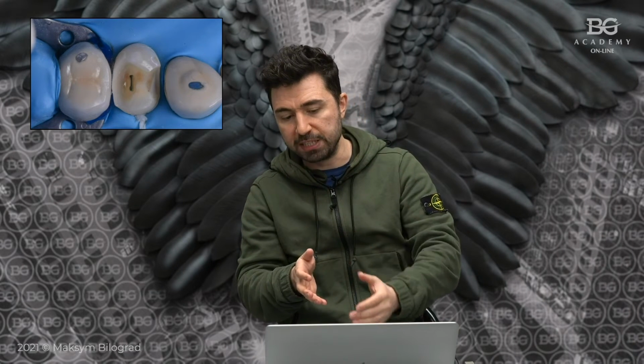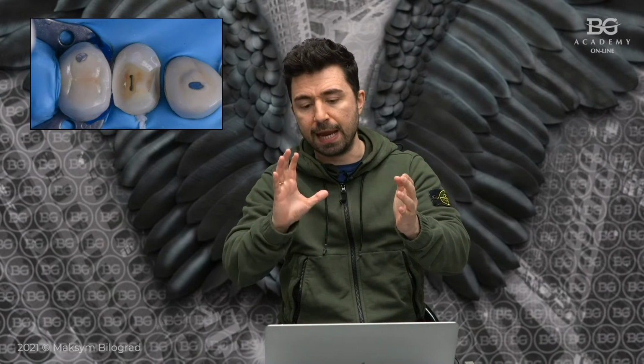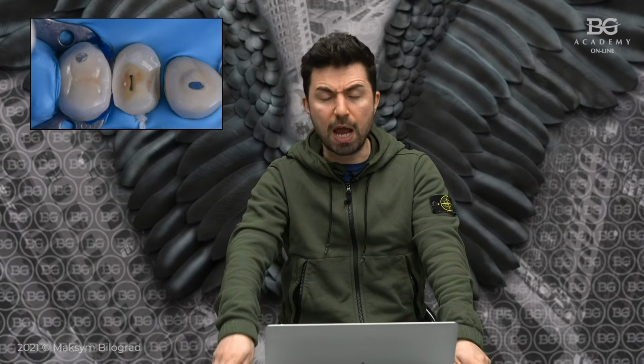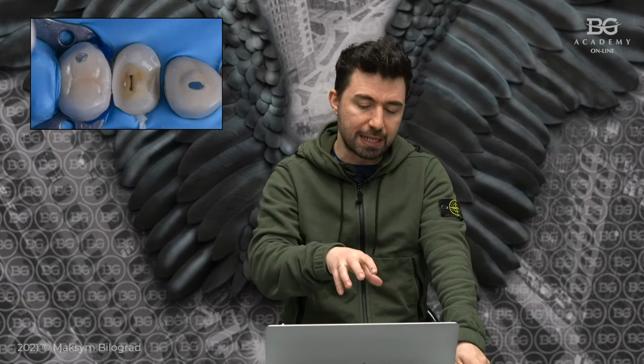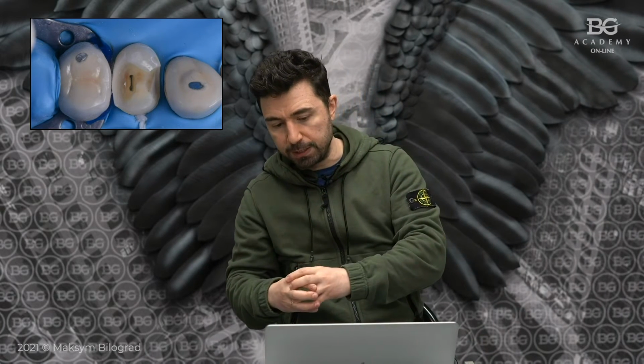In this case, I made it without bonding. So basically I just put a matrix, fill it with flowable composite, light cure, and then I have my proper conditions for root canal treatment. Why am I telling you this? Because for this case I planned to do root canal treatment and the restorative part together within one appointment.